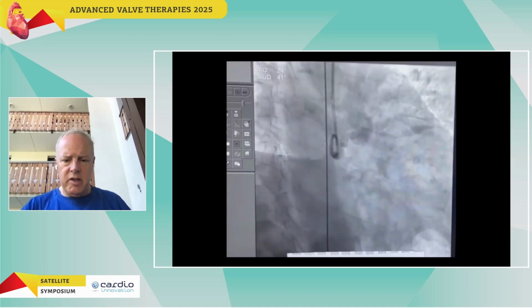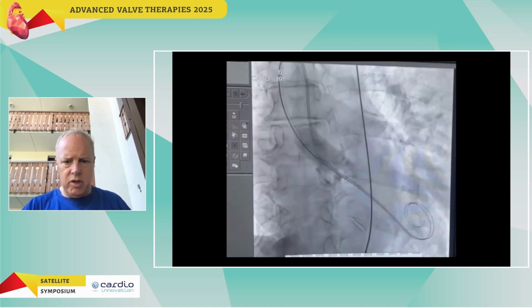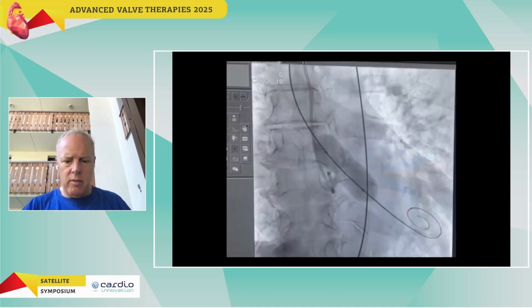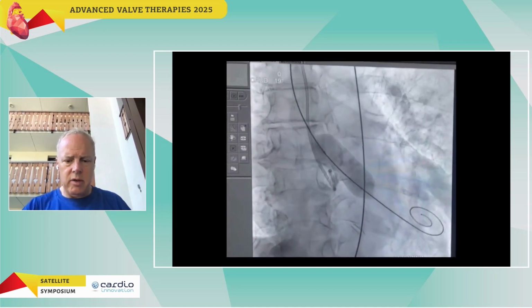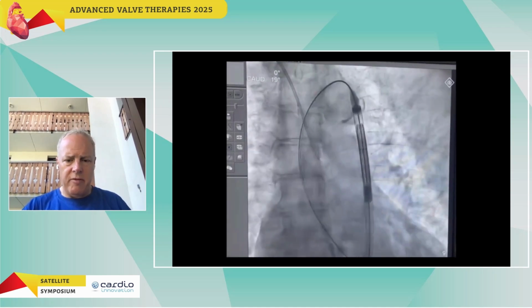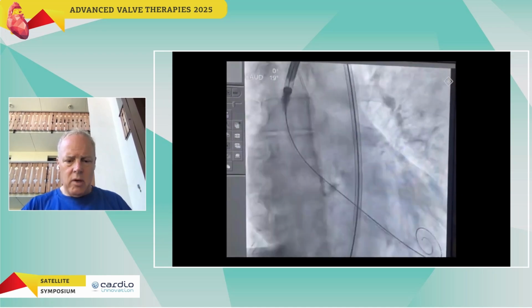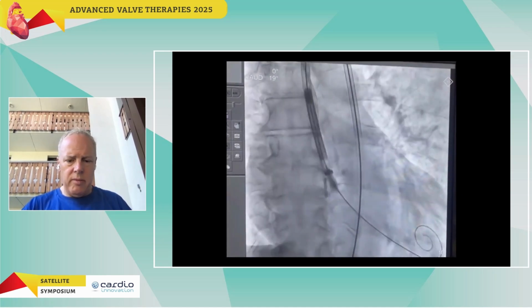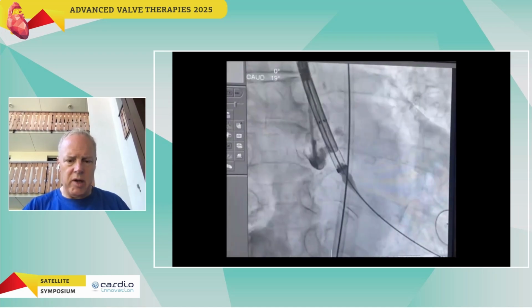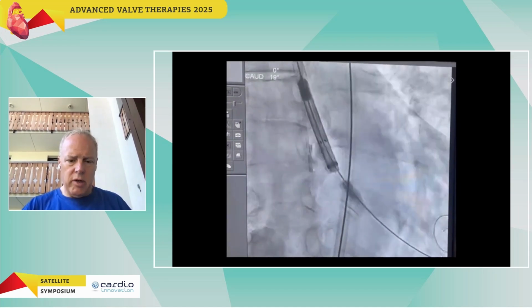This is the very first case that was done in Vigo by Dr. Bath. Pre-dilatation as before. Pacing on the wire, as we just saw with a case from Athens. It's still a very flexible delivery system, just like the PermaFlow, so it goes around difficult arch anatomy without any difficulty. We're in a cusp overlap view here, and you have to bear in mind this is the first time that anybody had ever used this delivery system to implant Allegra in a human patient. So he's going quite slowly and quite carefully.